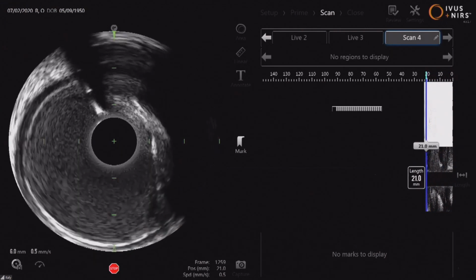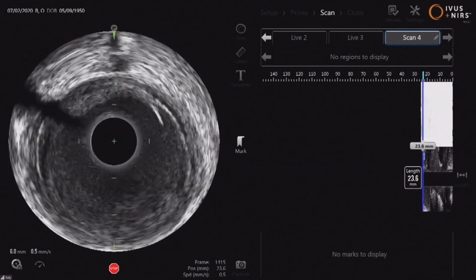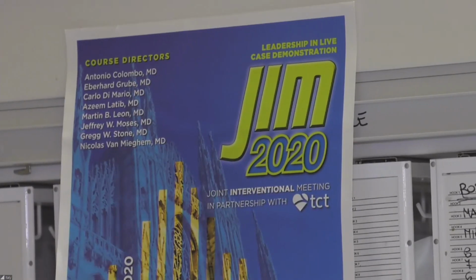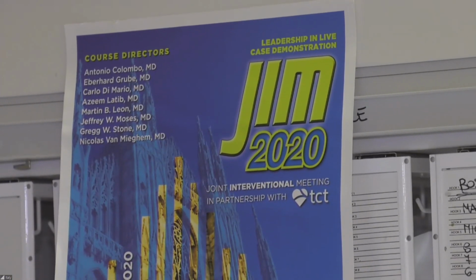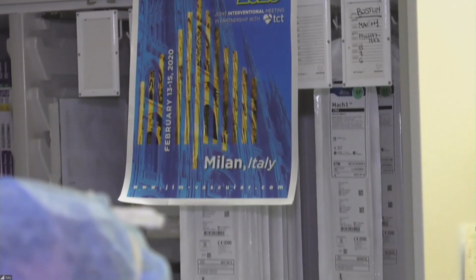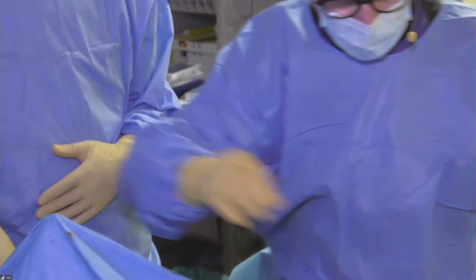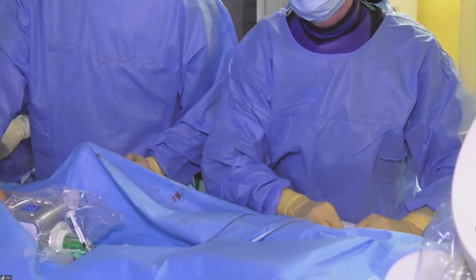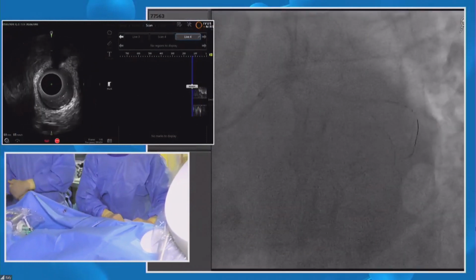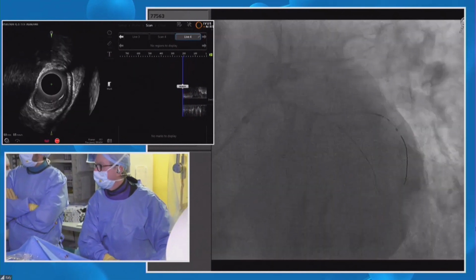Okay, so I think we learned a lot. Let me re-advance. Stop. Okay, live. I'm going to do manual advancement. Okay, I want to do manual. Here you are distal in the marginal. We are distal in the marginal.